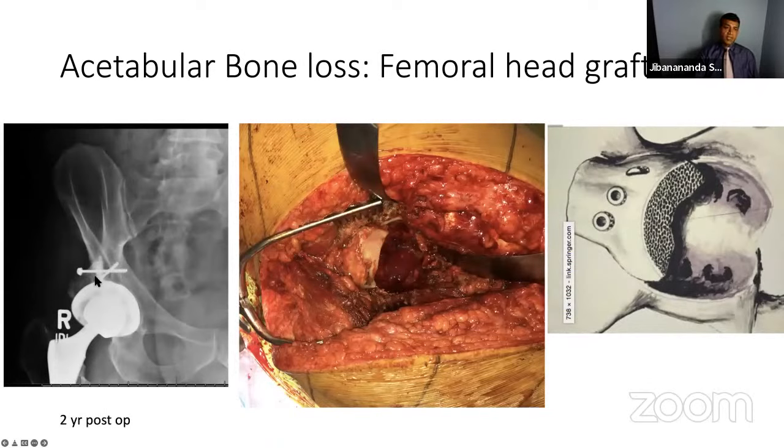This is nicely healed. This is a 2 year follow-up. You can see it's nicely incorporated. This is an example again in a pictorial description. This is the real intraoperative scenario, and this is a post-op case. And this might be quite helpful both in complex primary situations or revision situations, and probably avoid an augment in those situations.